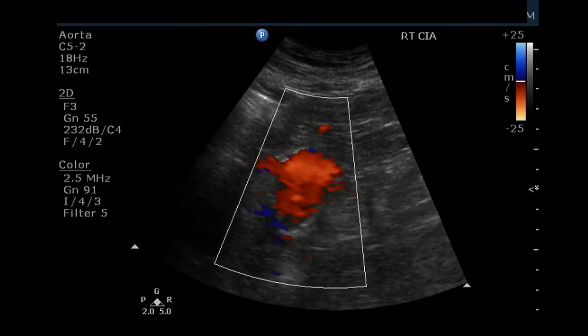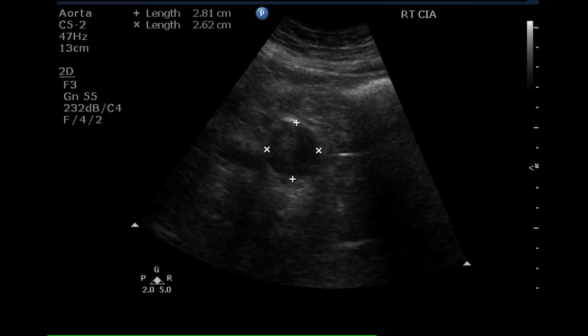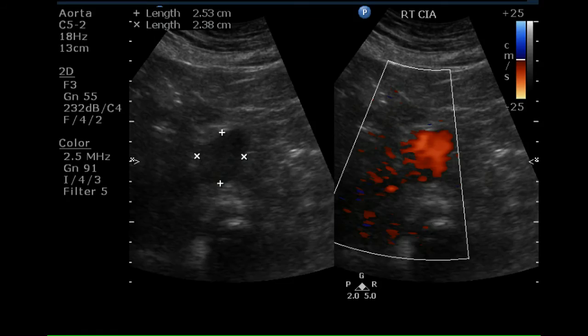This is a color Doppler of the right common iliac artery, which demonstrates that it is enlarged but fills completely with moving blood. The largest diameter of the right common iliac artery is 2.8 centimeters, indicating that there is an aneurysm in this vessel as well as in the aorta.